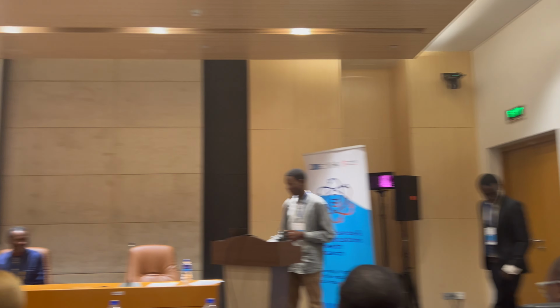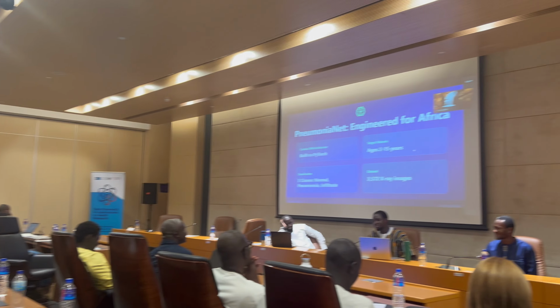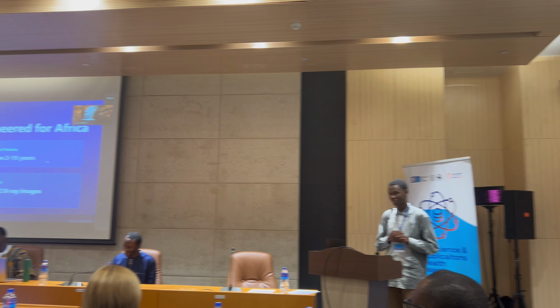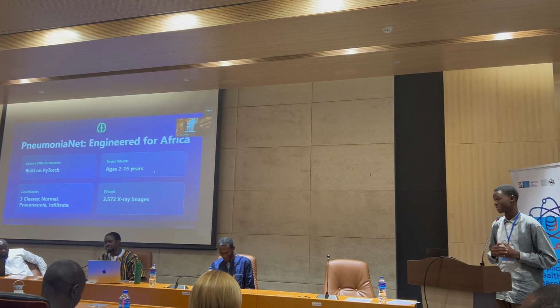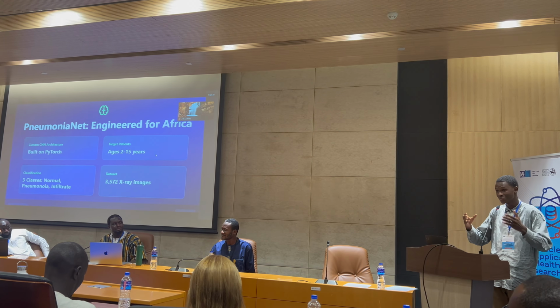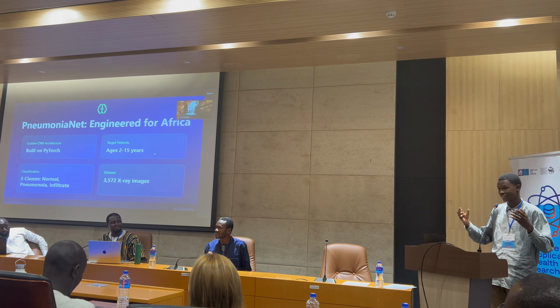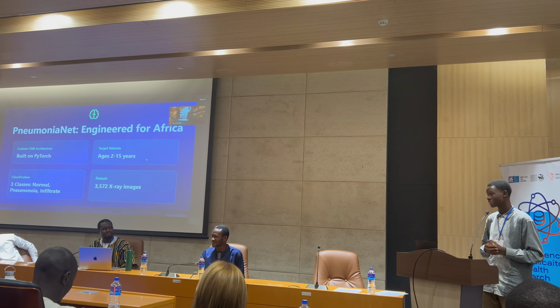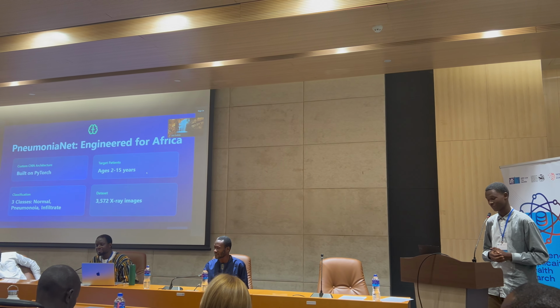And what does PneumoniaNet do? Well, PneumoniaNet is a very lightweight, built-from-scratch convolutional neural network model, and the size of it is 14 megabytes. To put this in perspective, it is literally less than most of your favorite TikTok videos. And it is built on the PyTorch framework.